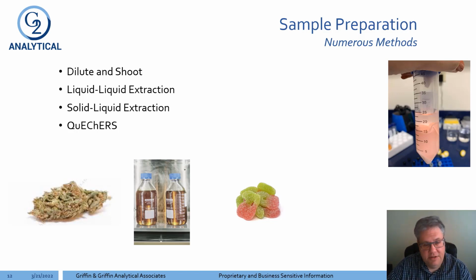When you do these gummies, we dissolve them in warm water to begin with, and then you add a slightly modified acetonitrile solution. Of course, that's miscible with the water that's in there. So you're getting a bit of liquid extraction going on at that point in time, because the gummy will completely solubilize in the water. And then you add your QuEChERS salts and you get the layer separation out.